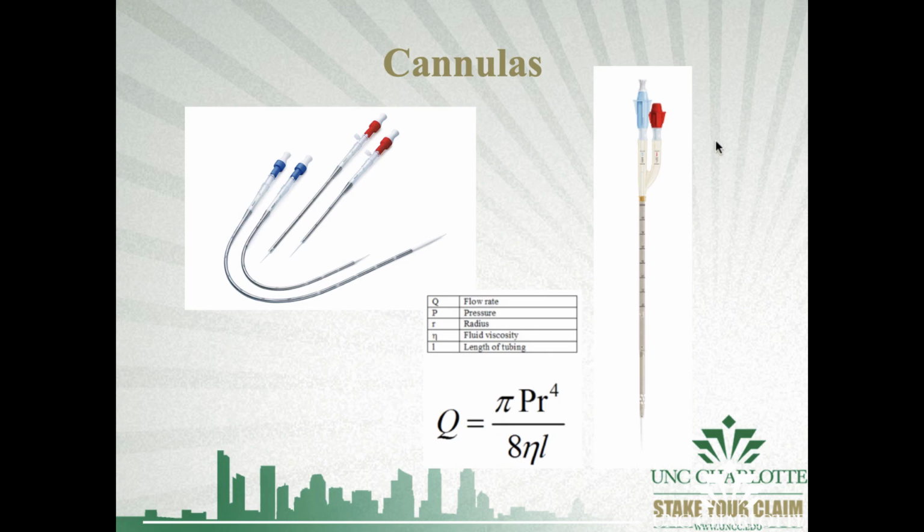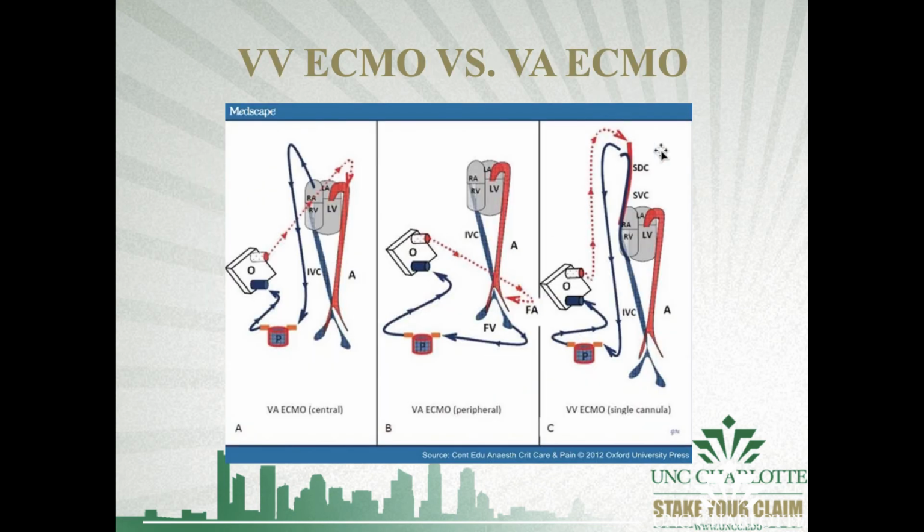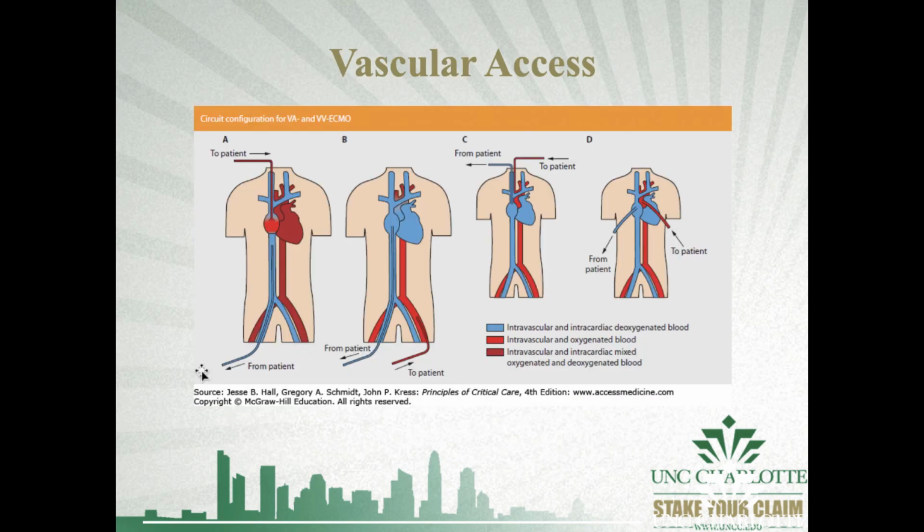with this double lumen cannula up here. We're going to put this into our IJ, internal jugular vein, and we're going to pass this down into our IVC. We're going to pull blood from our IVC, and we're going to dump it right back through that same cannula into our right atrium, okay? That oxygenated blood. Issues with this is that we have hepatic veins that this can get lodged into and cause some flow issues. You can also perforate the heart, which I've seen happen a few times as well, with the misplacement of this cannula or when the patient's moving around.